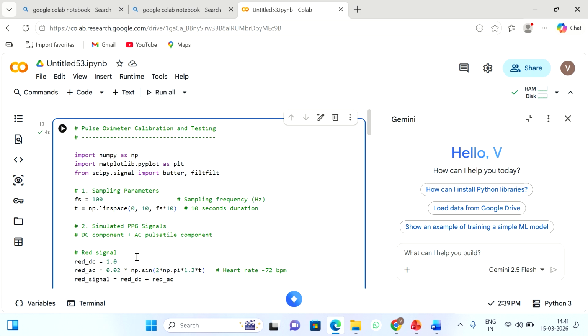The simulated PPG signal will have a DC component, the constant part, which is due to tissue, bone, and non-pulsatile blood. And then the AC component, the pulsatile part, which is due to the heartbeat. Then for the red signal, red_DC is equal to 1.0. Then red_AC signal is equal to 0.02 times np.sin(2 pi 1.2 t). That is a heart rate equal to 72 beats per minute. The red signal is equal to red_DC plus red_AC. So the total red signal is the combination of the AC component and the DC component. Red_DC is equal to 1.0, which indicates the baseline.